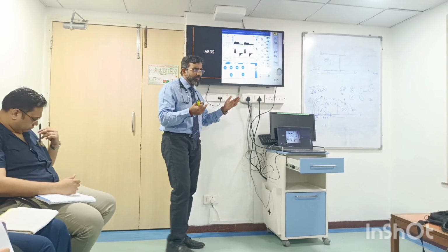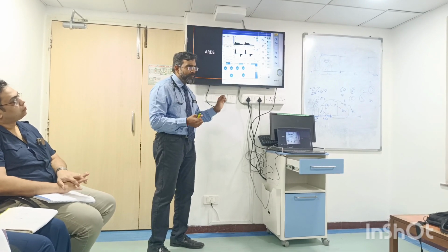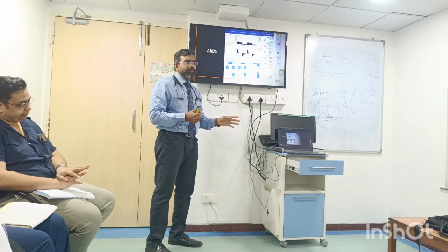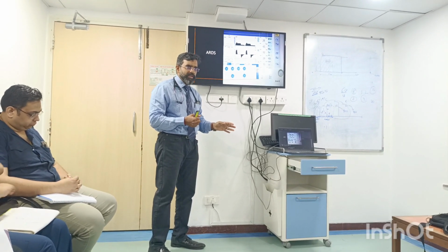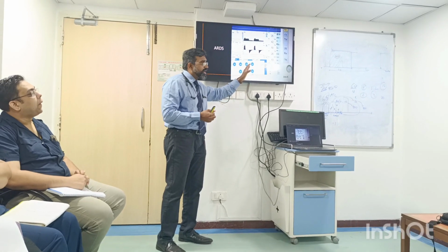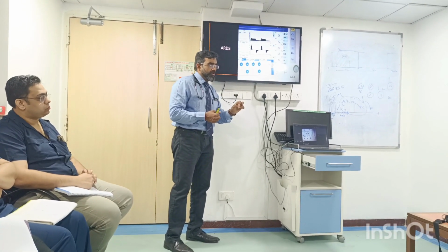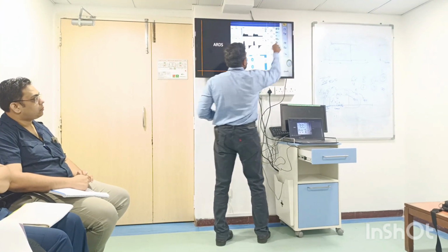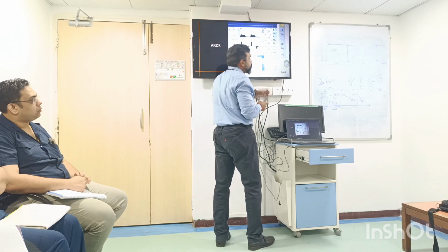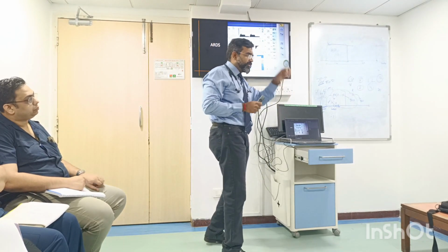The other thing that I must remember is, whenever I am touching any button on the machine, I have to see the alterations that are occurring in these numbers that I just explained to you, and at the same time, what is happening to my other numbers the moment I touch. So press every button. When I say press, you may want to do it this way, or you may want to do it this way. But you have to have that in your hand.